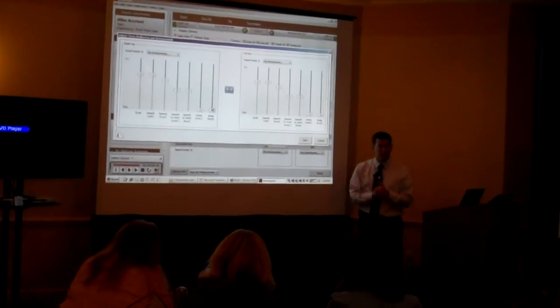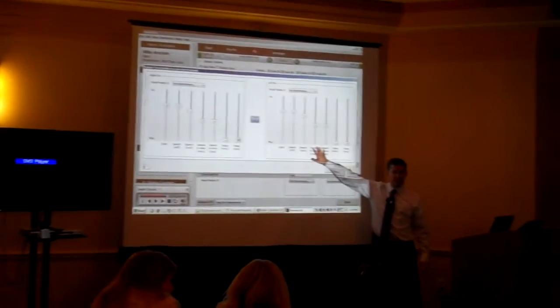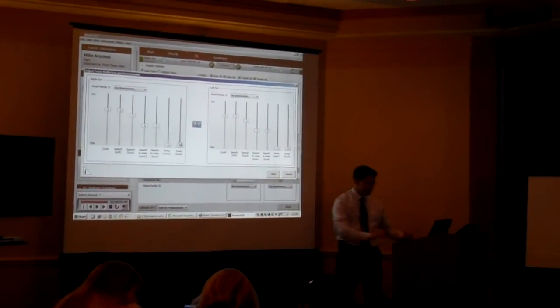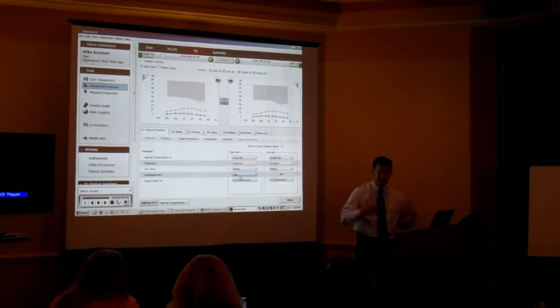That way your patient's more comfortable if they go in noise, because it's only noise. If it's speech and noise, it's not going to use as much noise reduction. Hit save, and now you've made that adjustment.